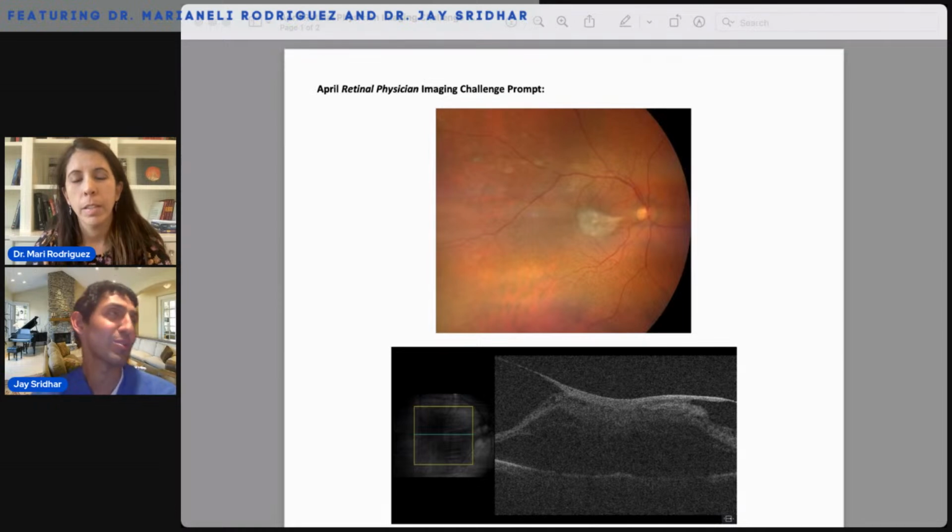And then where to start is always a question. I feel like when I was in training, the thing I was always thinking about was, do I start here? And as time goes on, it's really not helpful for trainees, but you sort of realize that you just take where it's showing you. Sometimes you have an area that stains really well or an area with an opening, but all things being equal, I think the most ergonomic place is usually 180 degrees from where your dominant hand is. So I'm a righty and this is a right eye. So if I'm doing a right eye surgery on this patient, probably the easiest place to begin is somewhere inferiorly, because it's a way for me to go and peel.